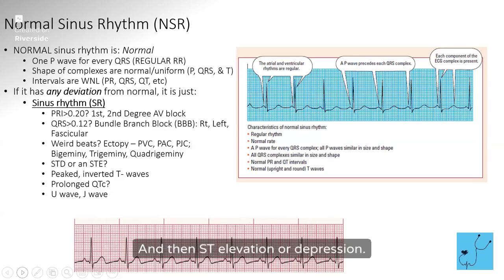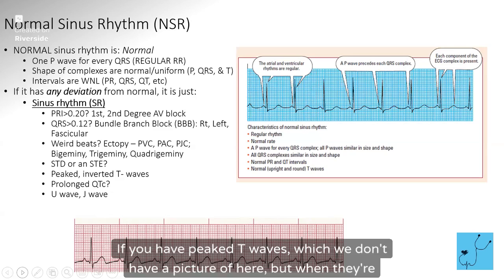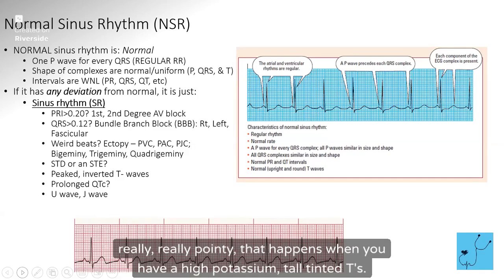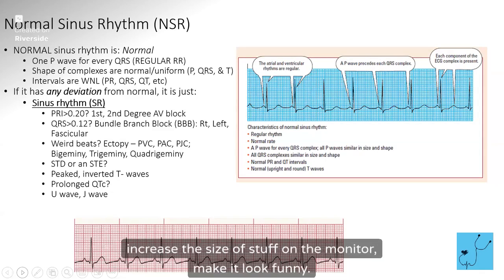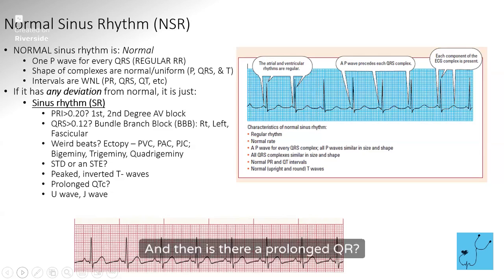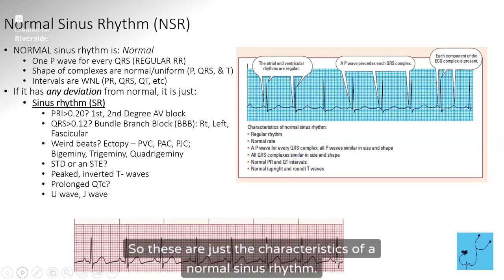And then ST elevation or depression. If you have peaked T waves, which we don't have a picture of here, when they're really, really pointy, that happens when you have a high potassium, tall tented T's. But it's only as good as the accuracy of the monitor, because you can increase the size of stuff on the monitor and make it look funny. And then is there a prolonged QT? Okay. So these are just the characteristics of a normal sinus rhythm.